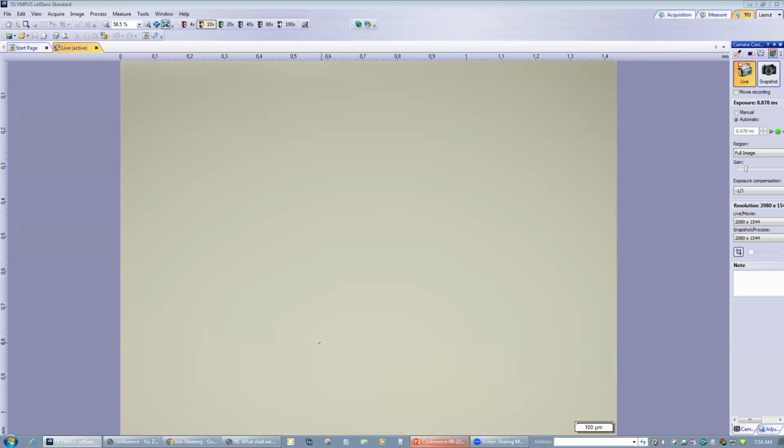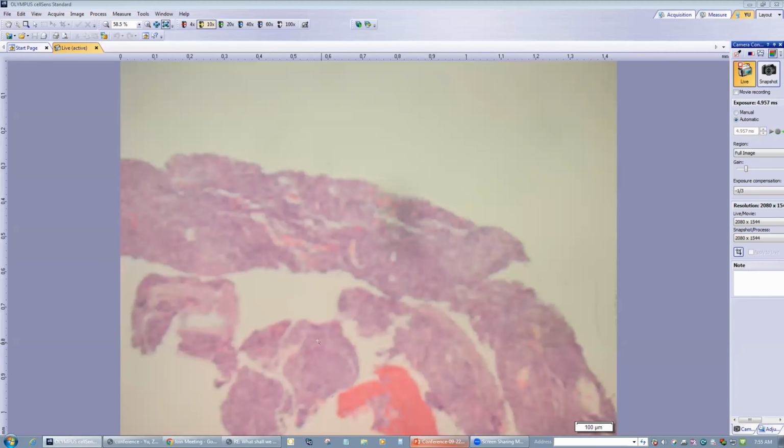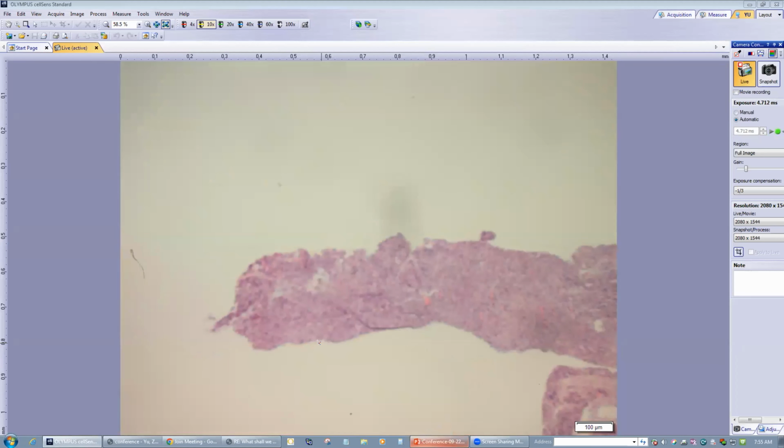If you suspect tuberous sclerosis and this tumor, radiology can find a fat component, which suggests this diagnosis. But here, although clinically suspicious, radiology said there was not much fat. So they did a needle core biopsy. So this is the needle core.